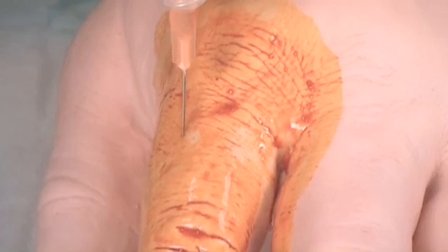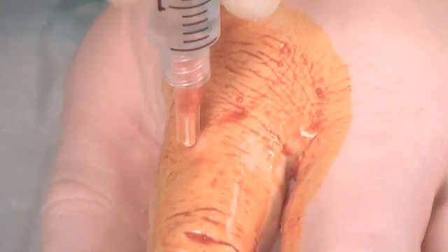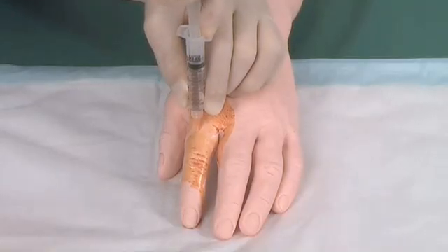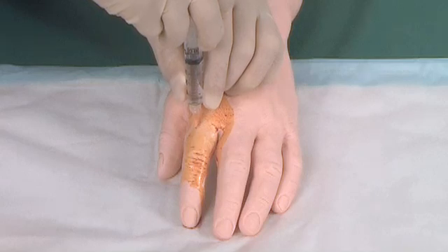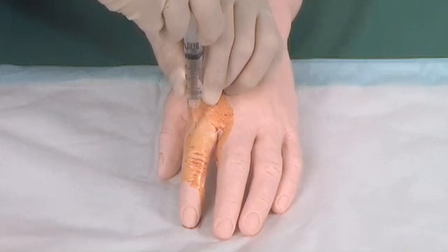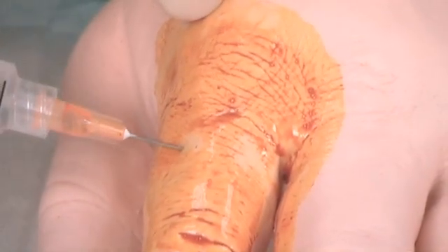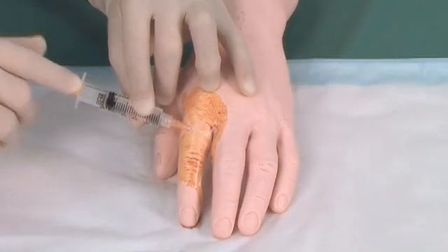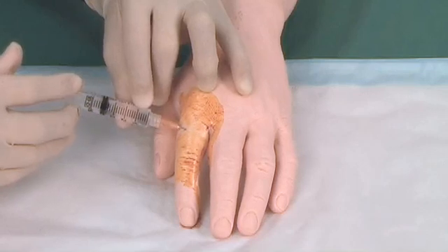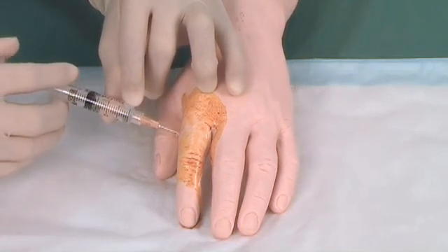Repeat this on the opposite side. This time withdraw the needle up to just beneath the skin surface only. Angle the needle across the dorsum of the digit and advance it subcutaneously without exiting the other side. Aspirate and infiltrate 0.5ml of lignocaine while withdrawing the needle completely.